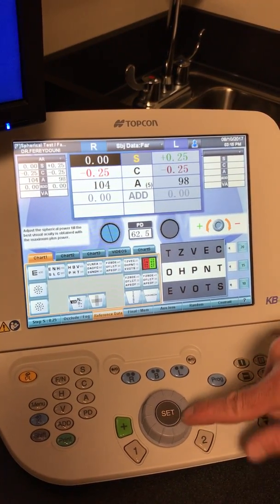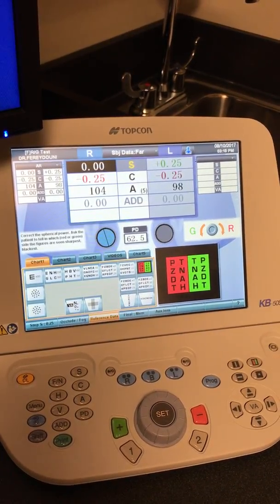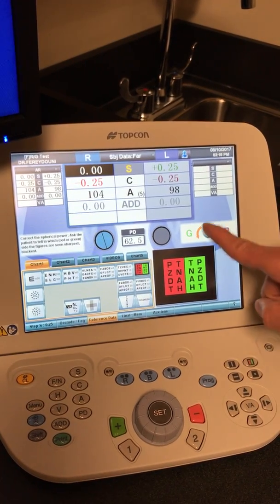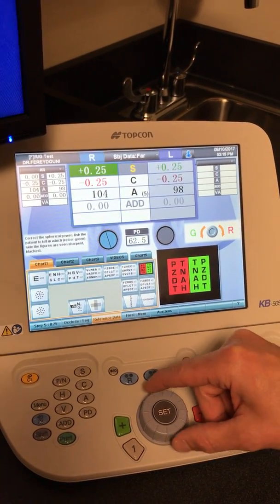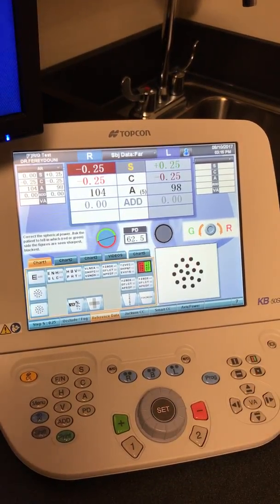Once you've done your initial VAs, you hit the set button. The set button will bring you on to the sphere testing part, and what we ask the patient is which is better — red or green — follow the green to the left, or follow the red to the right. When they say they're both equal, then you just hit the set button.